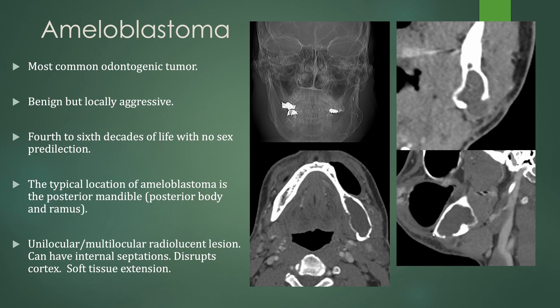An ameloblastoma is the most common odontogenic tumor. They are benign but locally aggressive, seen in the fourth to sixth decades of life with no gender or sex predilection. The typical location is the posterior mandible — the posterior body and the ramus. These are unilocular or multilocular radiolucent lesions with some internal septations. They disrupt the cortex and can have soft tissue extension. Notice these look a lot like odontogenic keratocysts, but in this case there is no associated tooth. It is a lytic expansile lesion with scalloping of the bone and some cortical breakthrough with a soft tissue component.